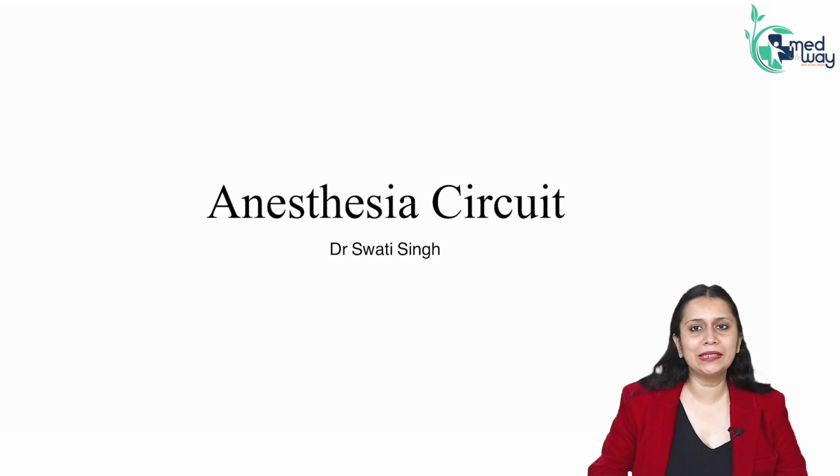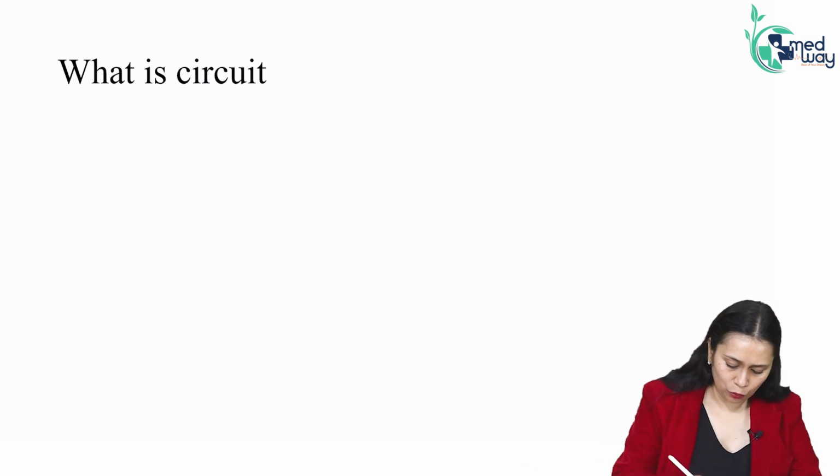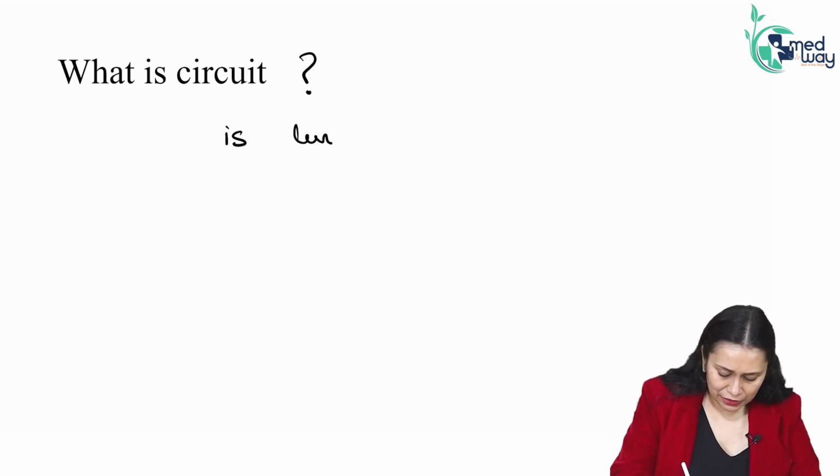Let us talk about anesthesia breathing circuit. So what is breathing circuit? It is a two-way connection between patient and anesthesia machine. It brings the inspiratory gases and removes the expiratory gases. So what is a circuit? Circuit is a two-way connection between anesthesia machine and patient.